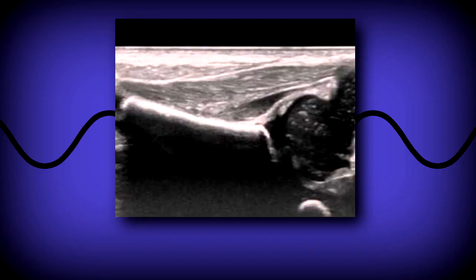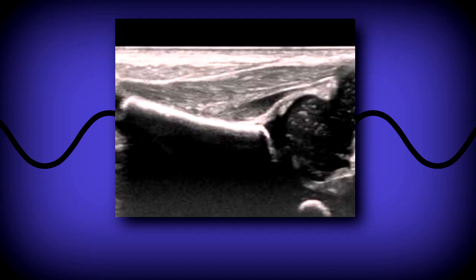When scanning, it's important to try to get the ilium as horizontal as possible, perpendicular to the beam. This can sometimes be a little hard — you'll have to tilt your transducer either anterior or more posterior depending on your angle. If the baby is moving a lot, this may also be difficult, but it is achievable. Even on an image where the angle is a little off, you will still get normal measurements, but it is always good to try to get the image as straight as possible.